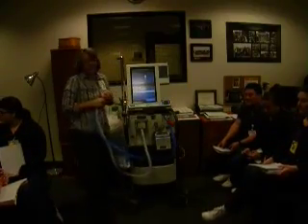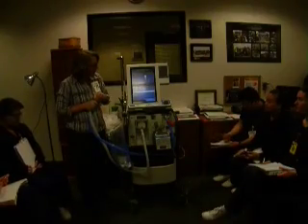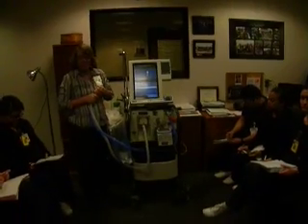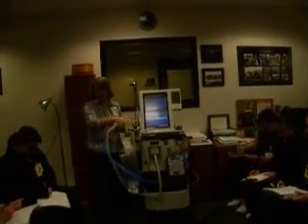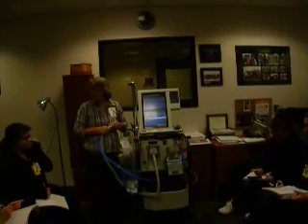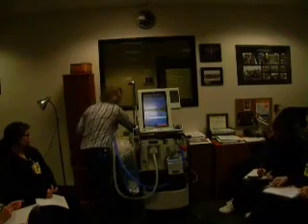All right, guys, this time it was the filter. Yep, the filter. See, now we're passing. So, just troubleshooting live. Okay, so now we got through that. So that was fine. You see, you have to just do a process of elimination. So now I know my circuit's probably okay, but this filter needs to be thrown away.